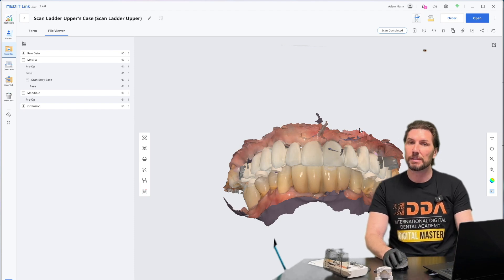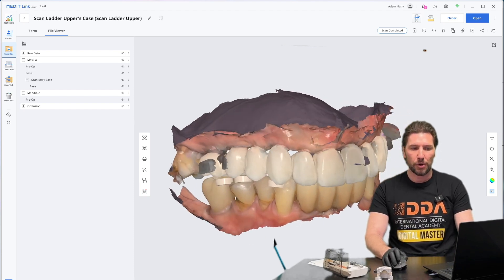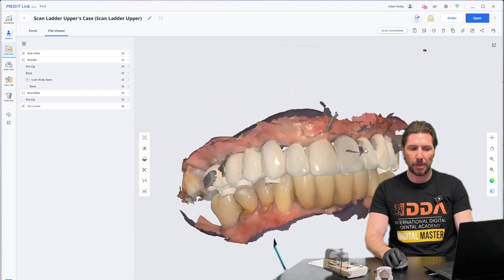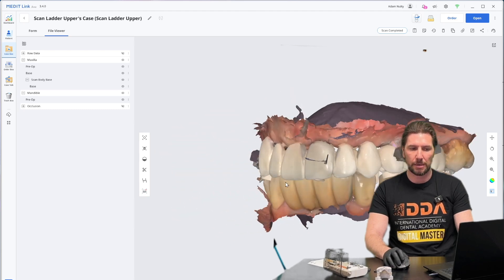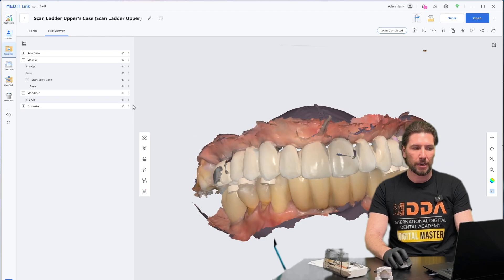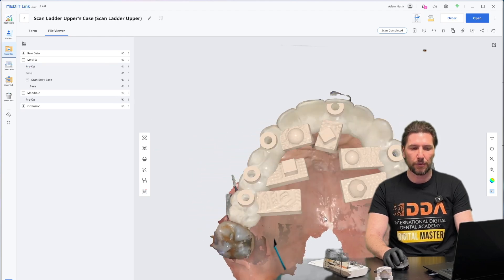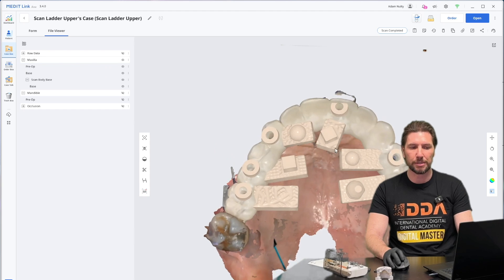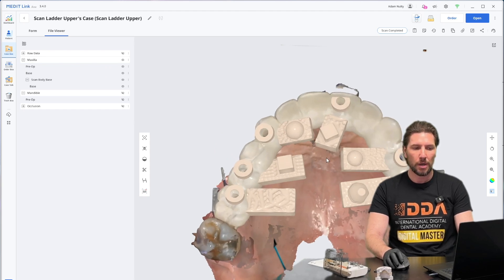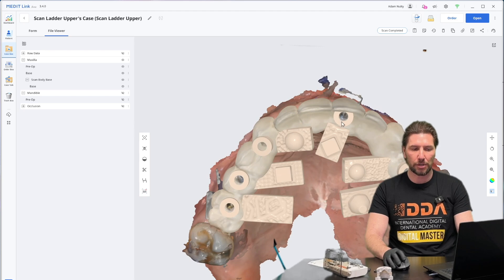We've scanned an upper arch where we have the upper on display — that is the temporary provisional. We've got the lower arch here, and if we turn off the mandible, we can also see that the virtual scan bodies that are registered with the MeditSmartX workflow are there, ready to be matched in.